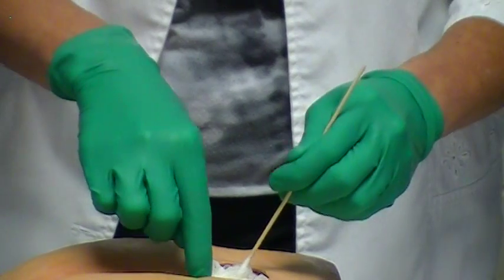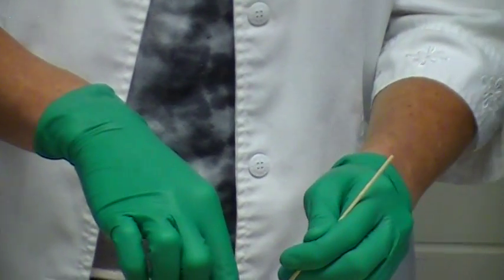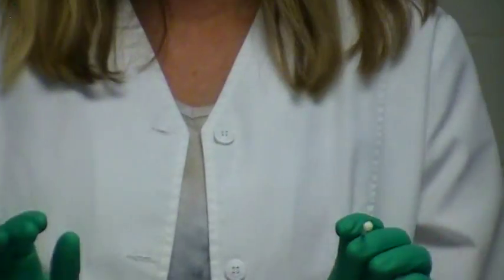And notice how I'm also using the finger of my non-dominant hand to help guide my dressing. If you have a wound that does not have any tunneling or undermining, you probably can use nothing but your hands to lay the dressing down into the wound, because remember, it's sterile to sterile. However, if you have undermining or tunneling, you'll need to use your Q-tip to help guide it into those areas. Okay, once you're done with this, you can dispose of your Q-tip. Once again, don't drop below waist level with your hands.